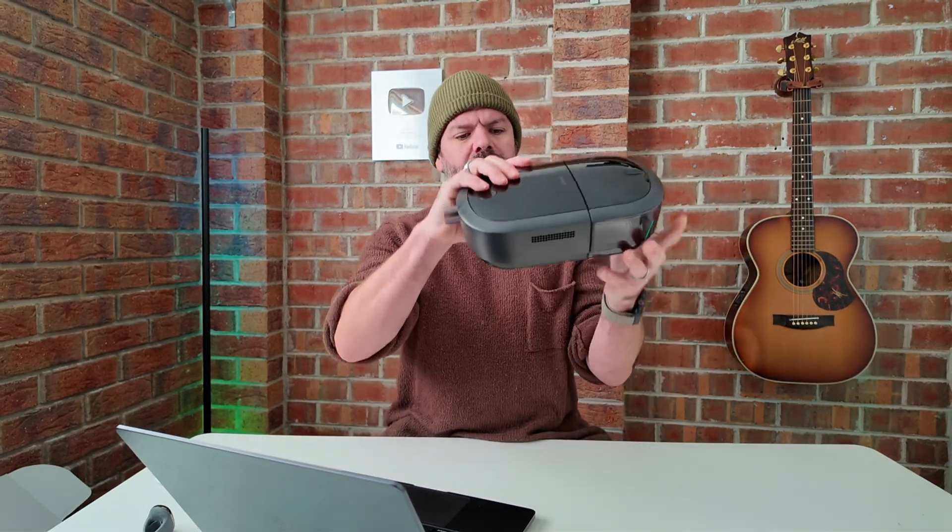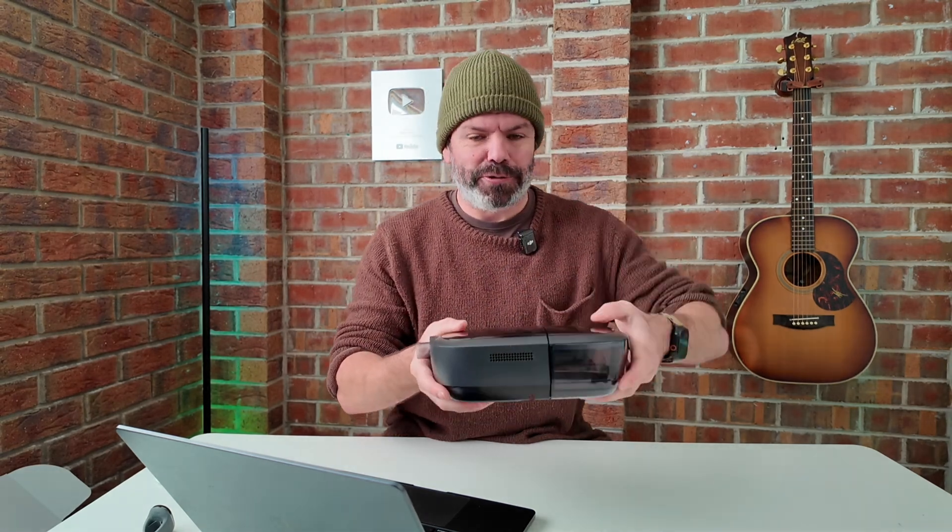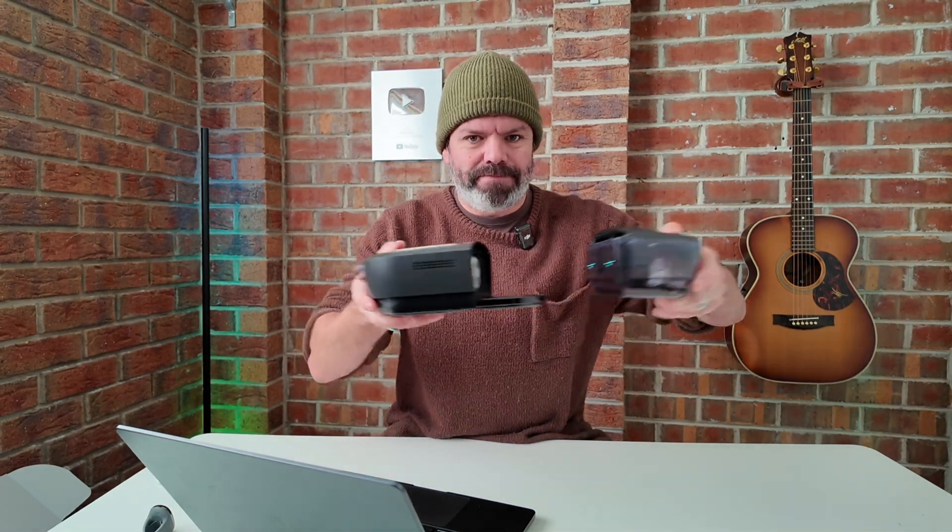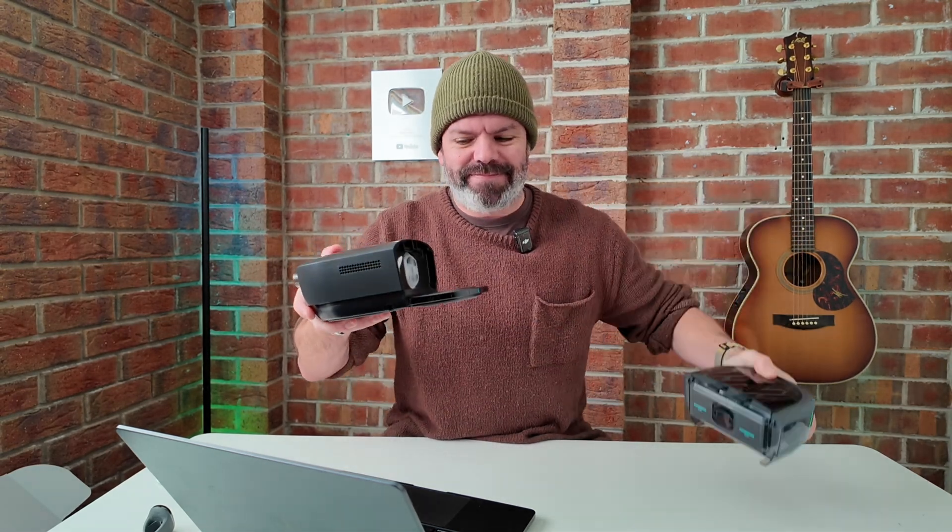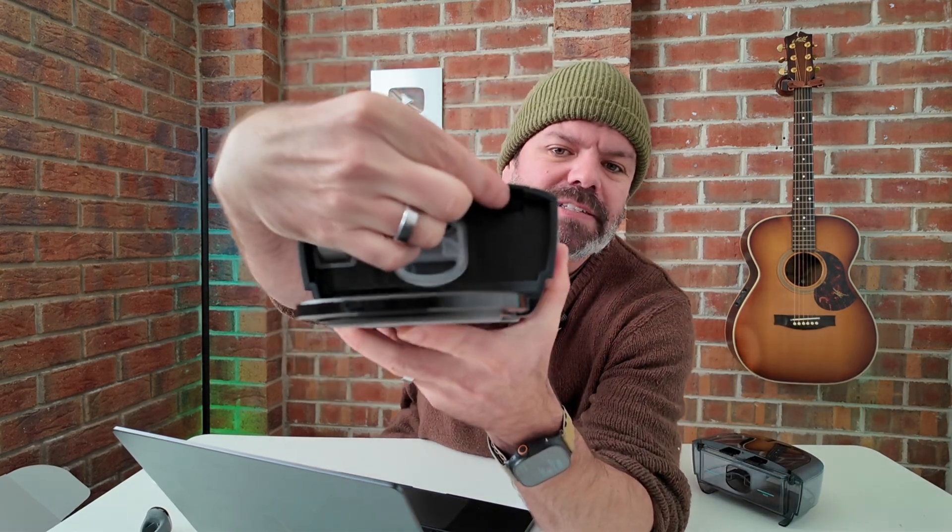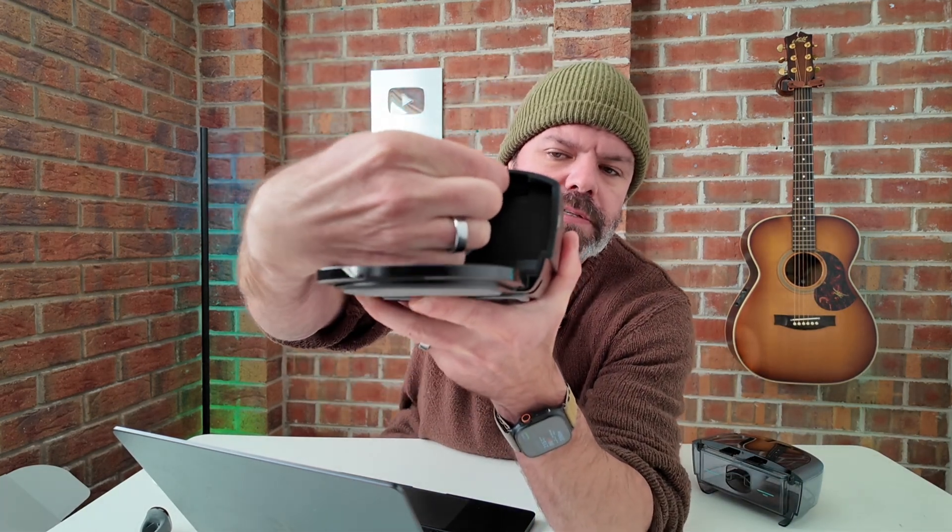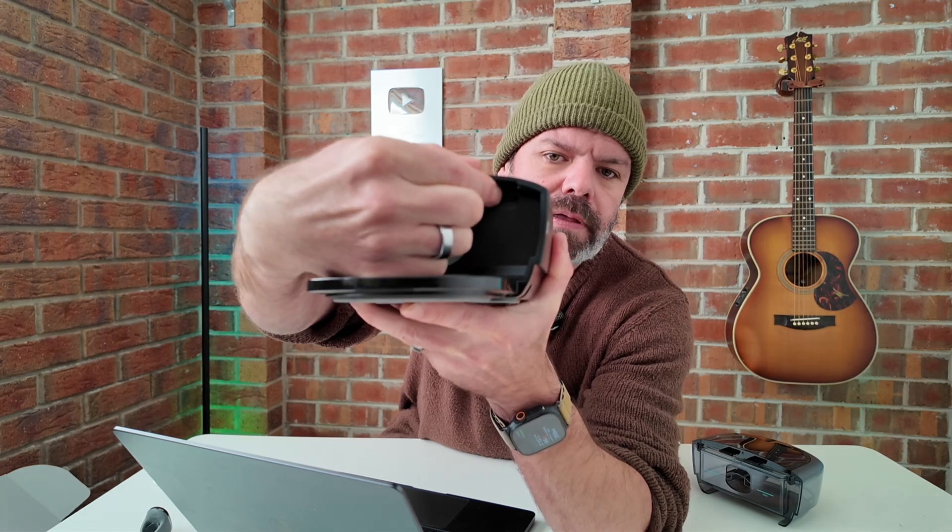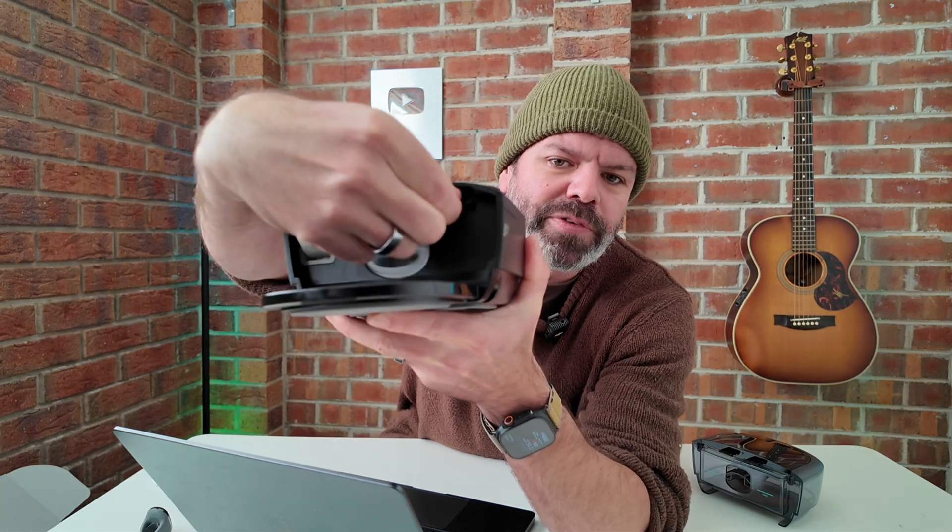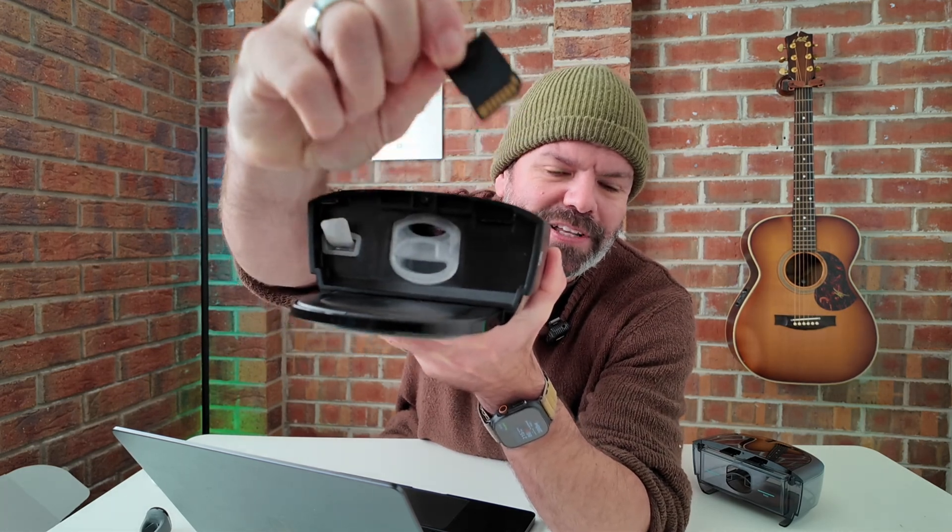Now where do we find the SD card on a DreamStation 2? It's hidden, it's in here. So we press, it pops out, there it is.